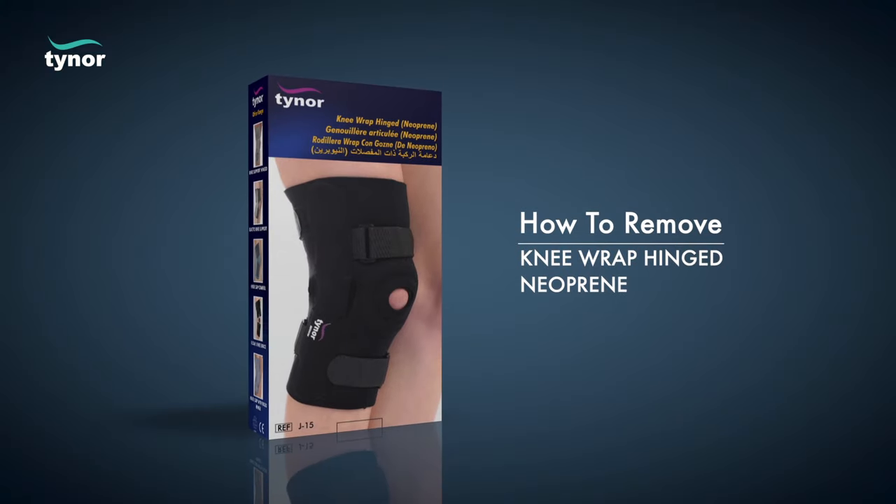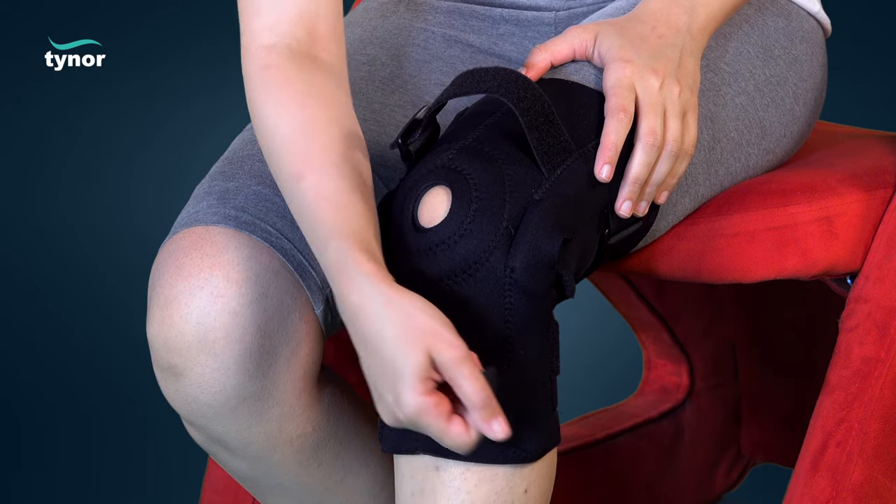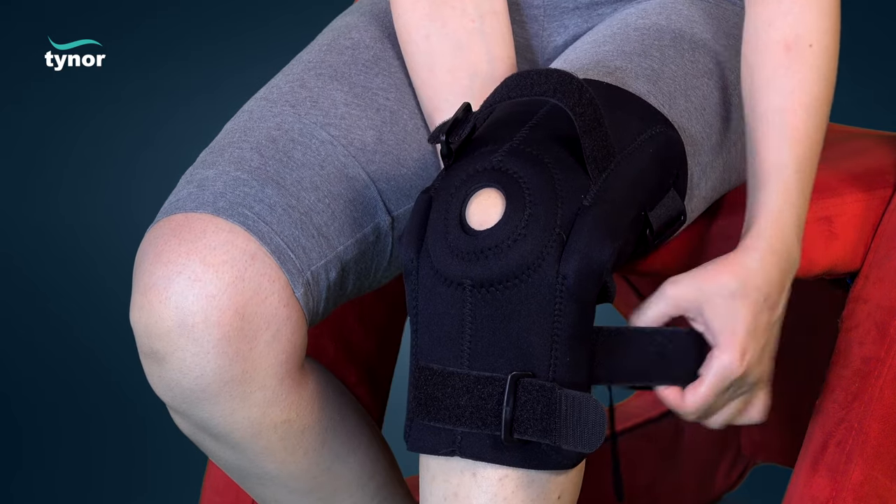Now let us see how to remove the knee wrap hinged neo. Unfasten the hook loop fasteners.